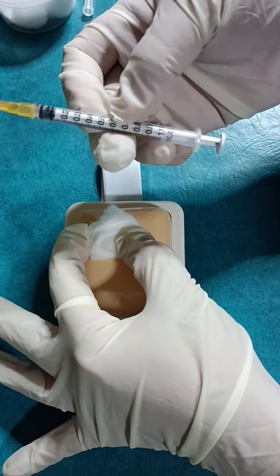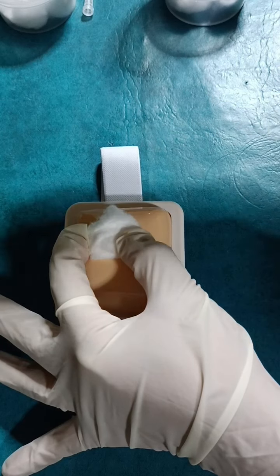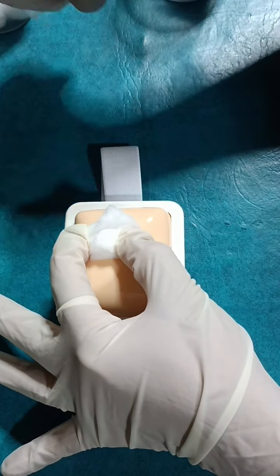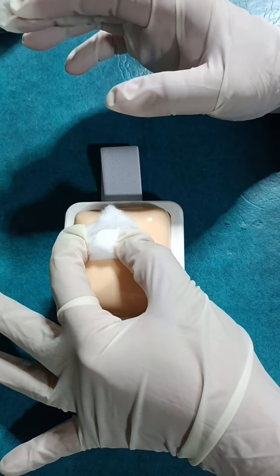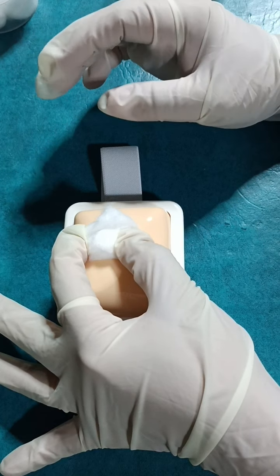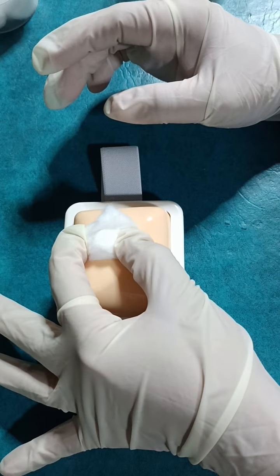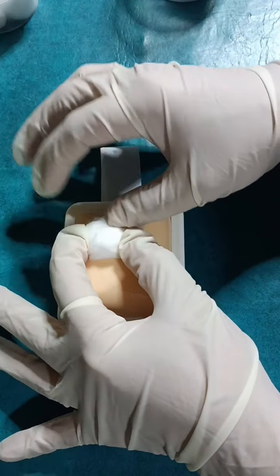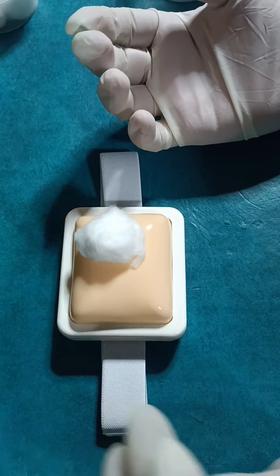Put the used syringe in the proper waste receptacle to avoid finger injury. That's all. So this is how you do a subcutaneous injection.